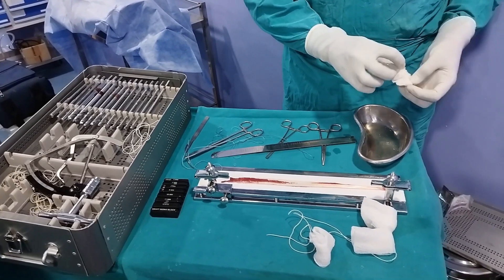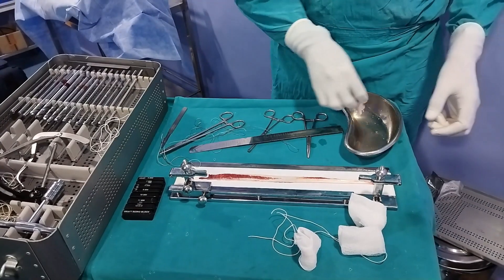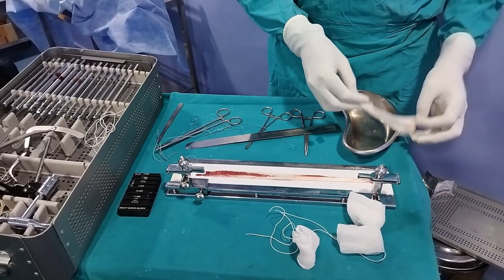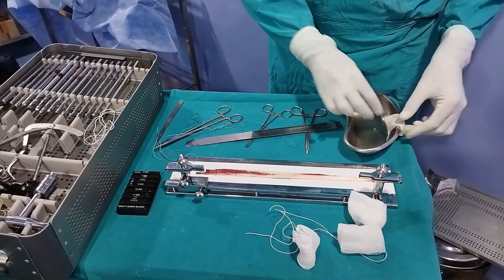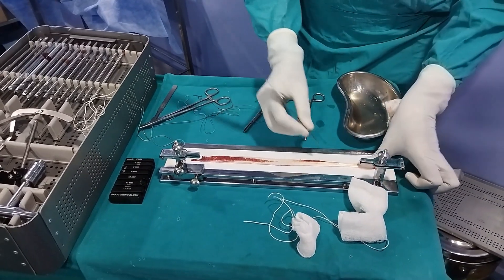Just keep it moist — don't wet the graft, otherwise it will swell up and increase in size. After surgery, inside the body it will shrink, which will cause a decrease in the strength of the graft.